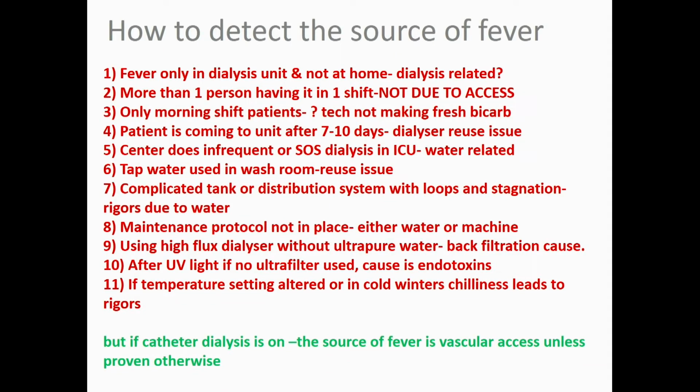Remember when you use, say, Renaclin or Imoclin or whatever for reuse, the effectiveness doesn't last more than 5 to 6 days. Maximum, I think you could use it for 7 days, but it's always risky. So it's best to use 24 to 48 hours ahead. You reprocess your dialyzer tubing and then use it. So those who have come after a gap to your unit, and if the technician has used the same old dialyzer tubing, remember, that could be a problem.